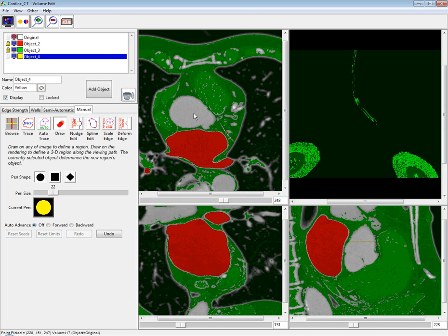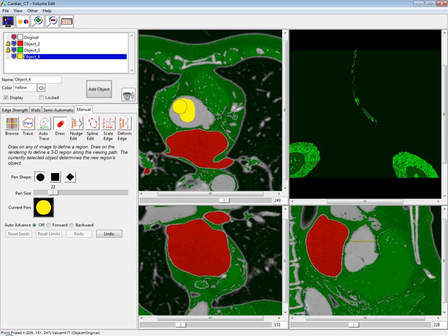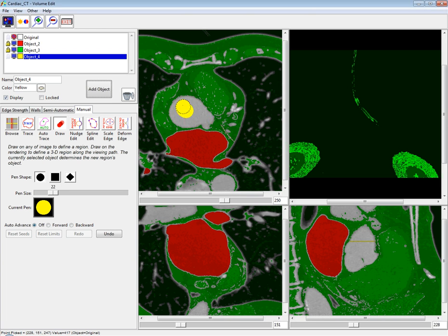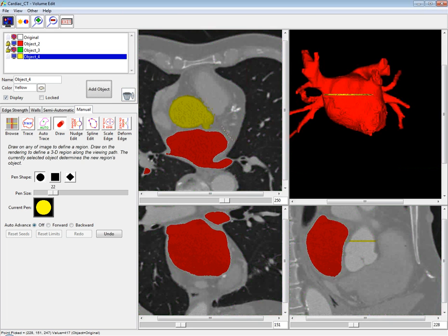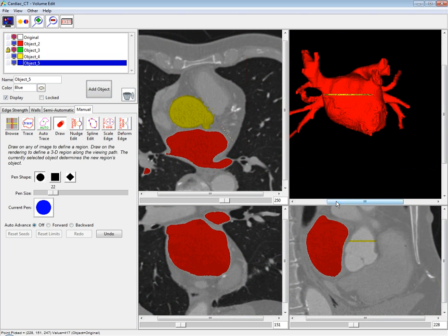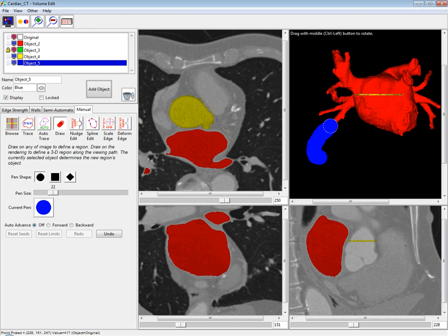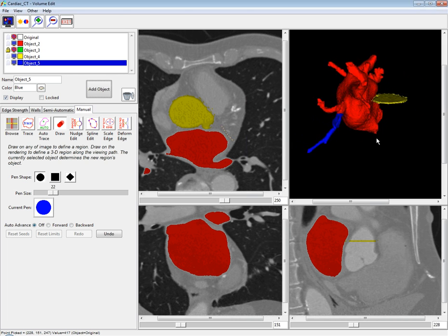I can move to my next slice just using the scroll wheel on my mouse. This can make certain types of segmentation a lot faster. The draw tool can also be used to define regions directly on the rendering. If I paint over the rendering with my draw tool, those voxels are immediately changed and cut all the way through.